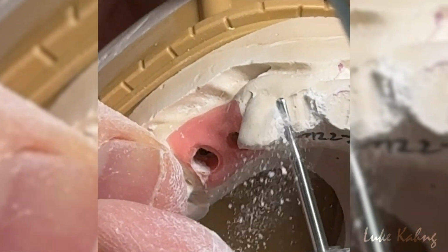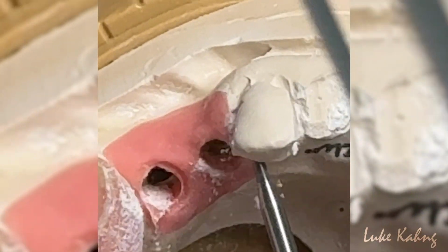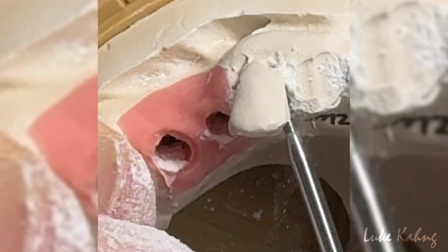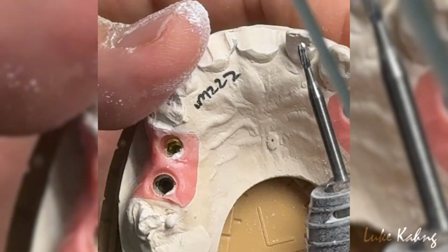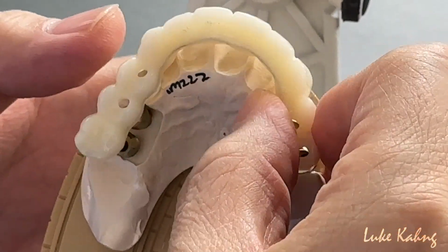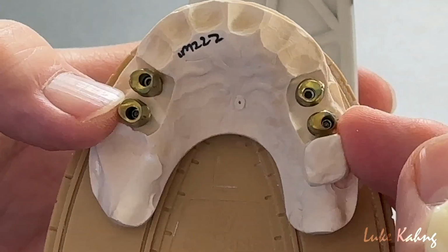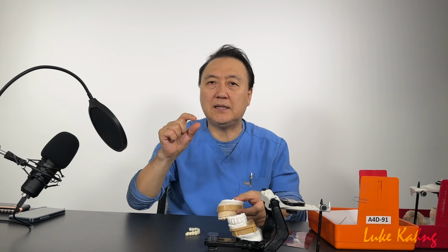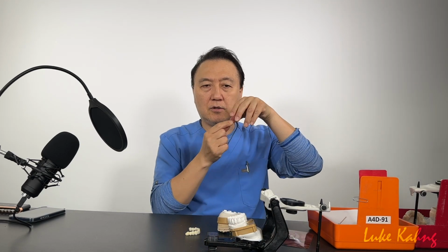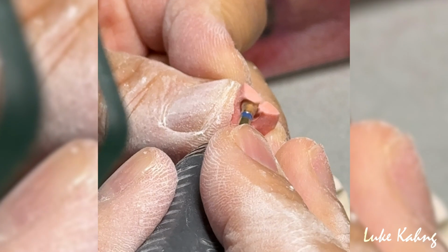Number two tip, I have to make the custom abutment instead of the Ti-base. Most of the time, dentists are trying to save money and they put in a Ti-base, which is bad because this is big. If you use only the Ti-base in between, both two here and two there, and the patient wears it 3 to 6 months, it is not going to work. What it causes with the Ti-base is cementation failure, so it will not stick together. After 6 months, the doctor will get a phone call from the patient because they're falling apart.